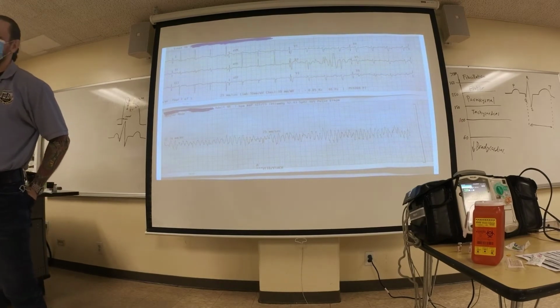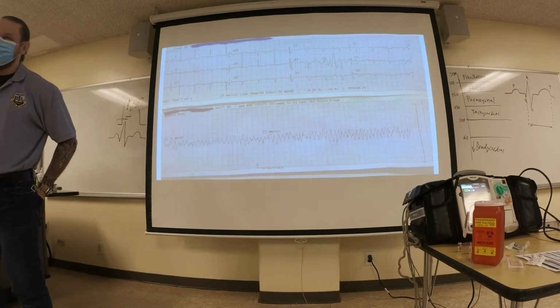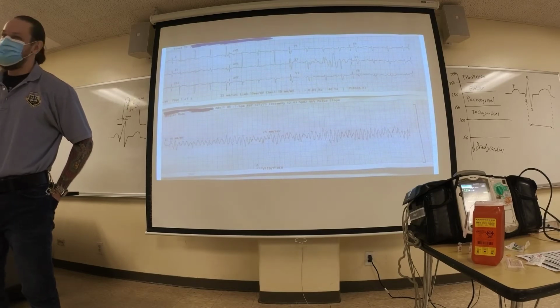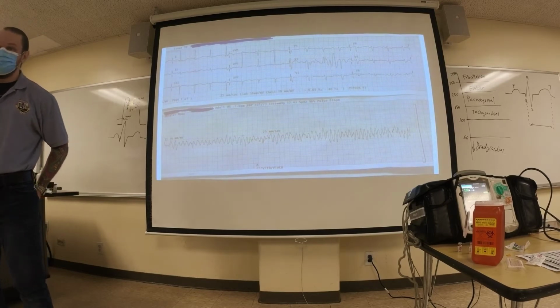It's beeping V-tach. You're like, let's shock it. Let's get amiodarone going. This poor guy, right? He's going to get shocked, and then he's going to get some amio to go with it, right? So please, if you're not sure, do the 12 lead, right?